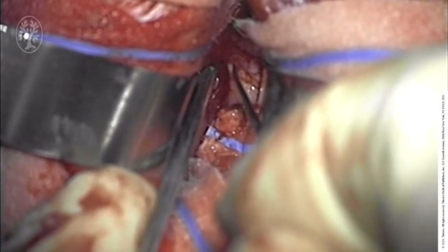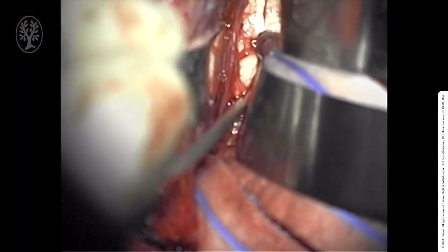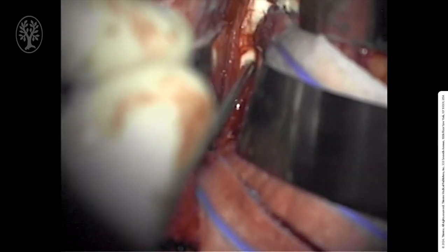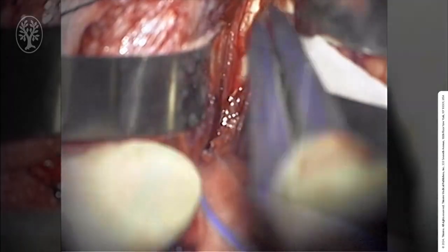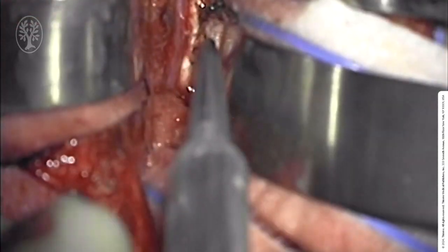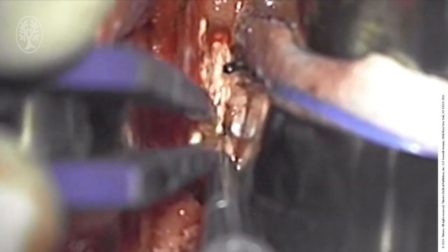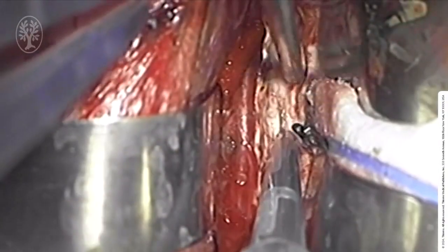After the adhesions are divided, the pericallosal branches of the anterior cerebral artery may be visualized. The corpus callosum appears noticeably white in contrast to the surrounding cerebral cortex. We have chosen to open the corpus callosum to the right of the ACAs, given the tight adhesions encountered in this patient. Frequently, these vessels may be separated to allow for direct dissection between them through the corpus callosum into the leaflets of the septum pellucidum.